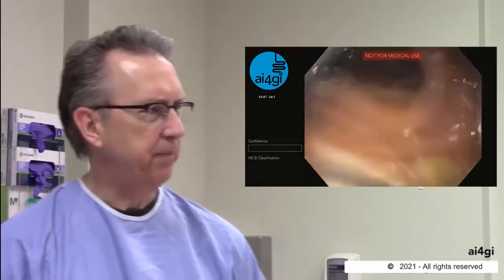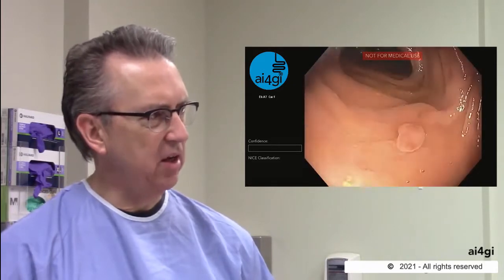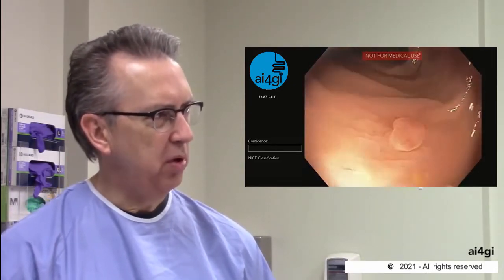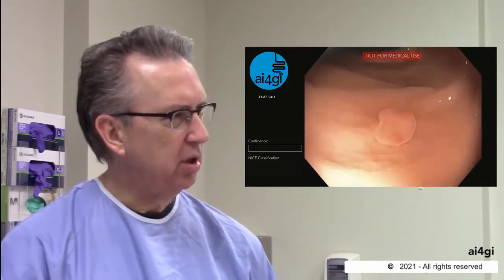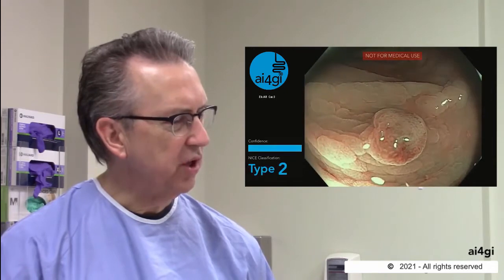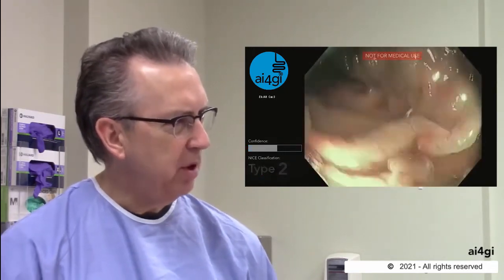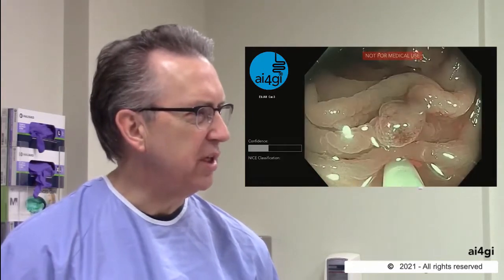Now we have the sigmoid colon, still with our pediatric scope. We've got about a 5 millimeter lesion. We'll take a close look at it, and the program is telling us that this is a type 2 lesion.